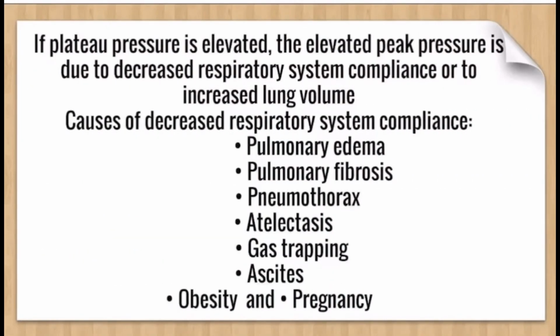Now, if the plateau pressure is elevated, the elevated pressure is due to decreased respiratory system compliance or increased lung volume. So, if you have done the inspiratory pause maneuver because the peak inspiratory pressure was on the higher side, and now you are getting elevated levels of plateau pressure, it could be a result of an increase in the volume, or a result of a decrease in the compliance.